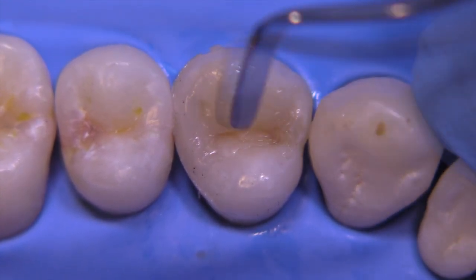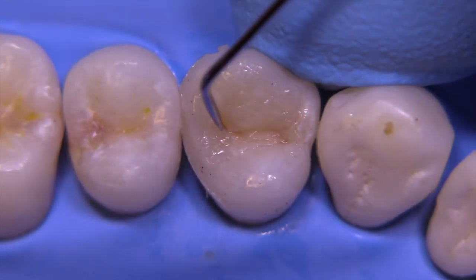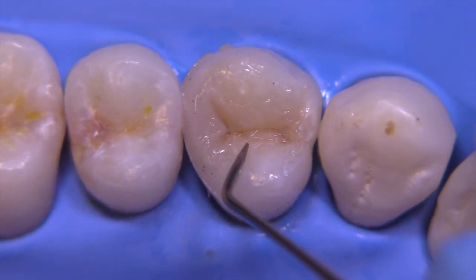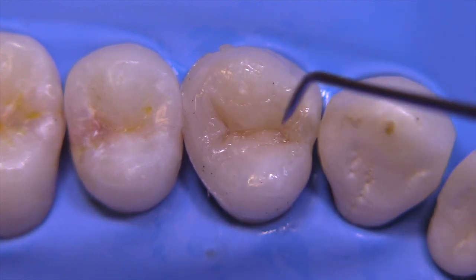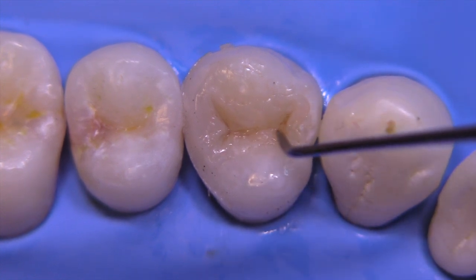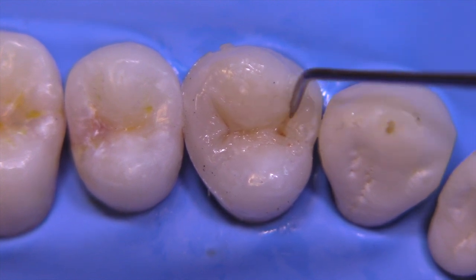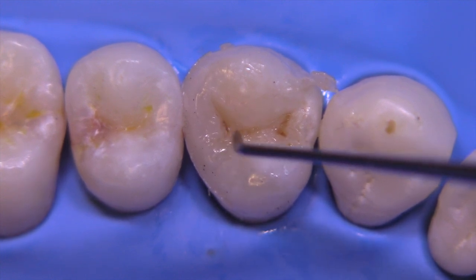I'm utilizing the IPC, now switching over to the pointy instrument in the Compo Sculpt system. You just continue to develop the morphology based on what you believe it should look like, guided by the adjacent teeth, your knowledge of the contours of the triangular ridges, the occlusal relationship, and so on.